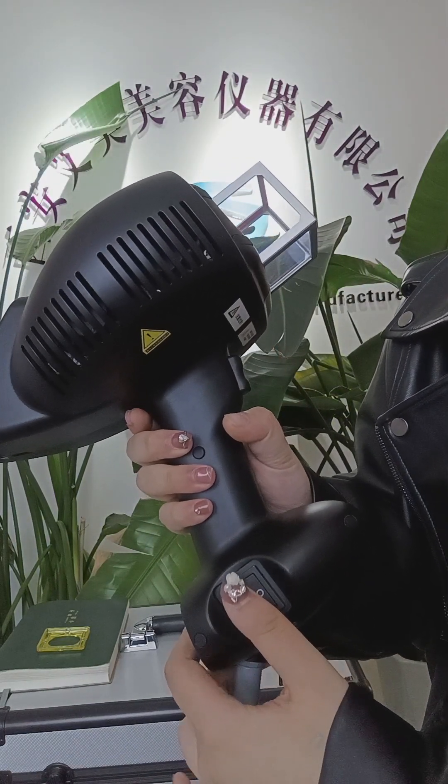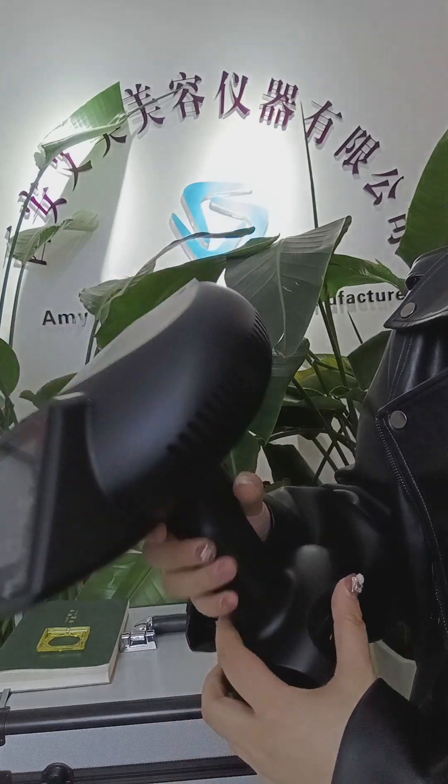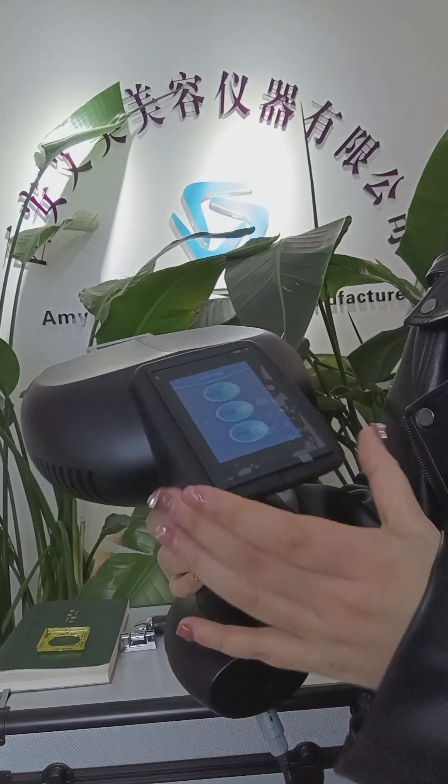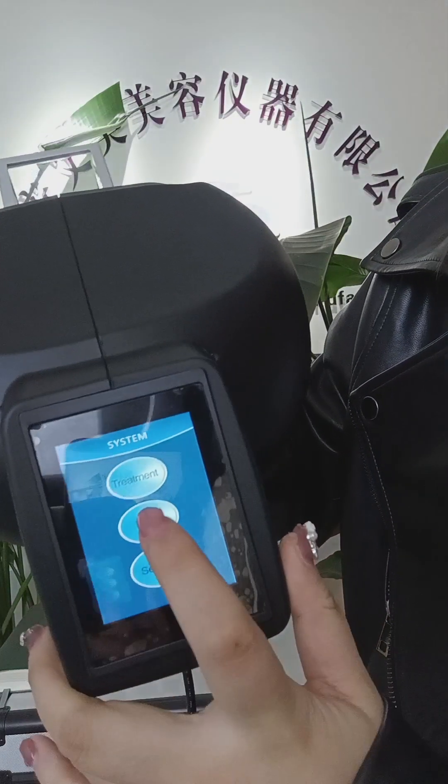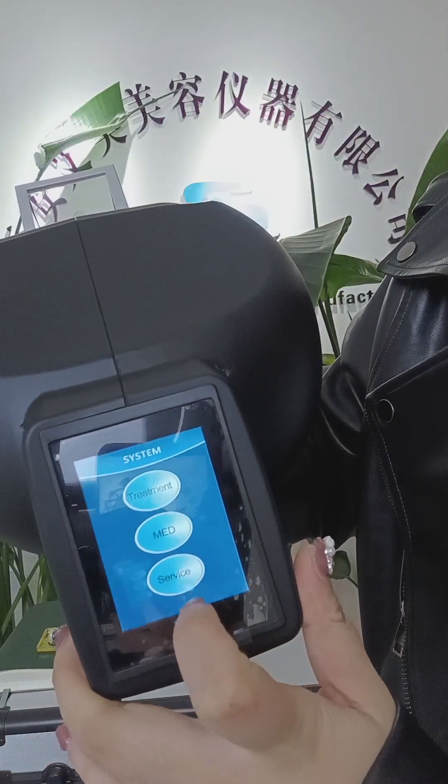This is the start button. This machine has three modes: treatment, MED, and service.